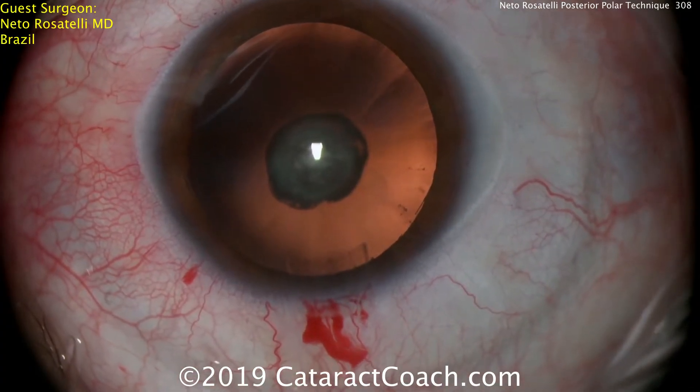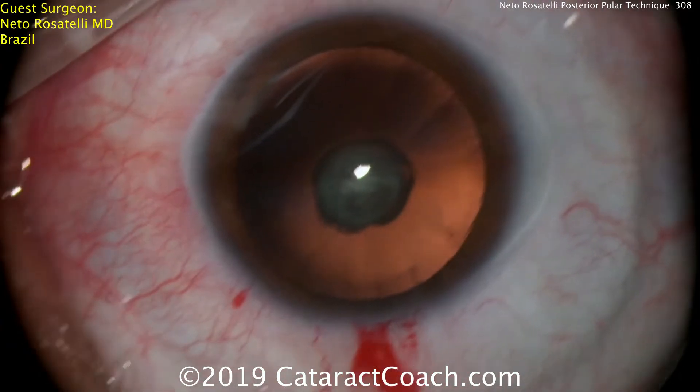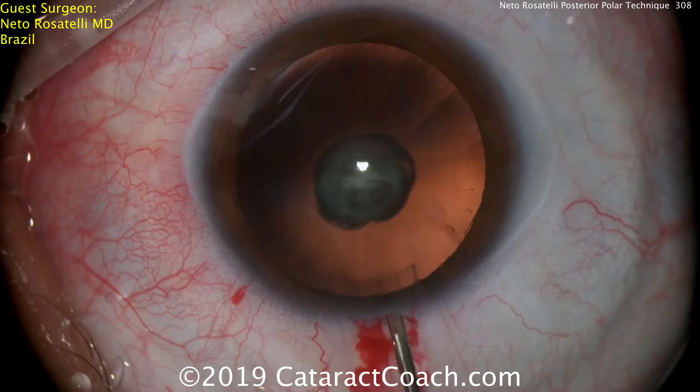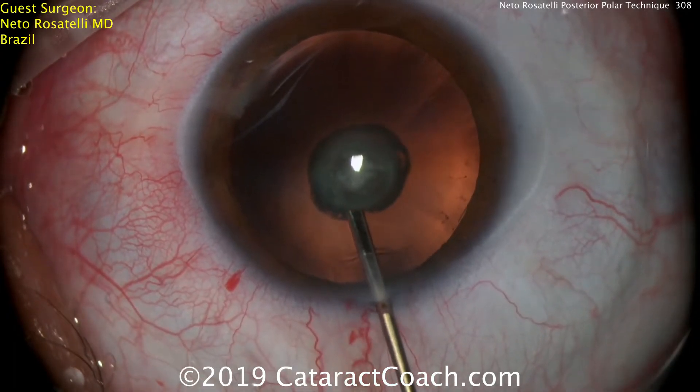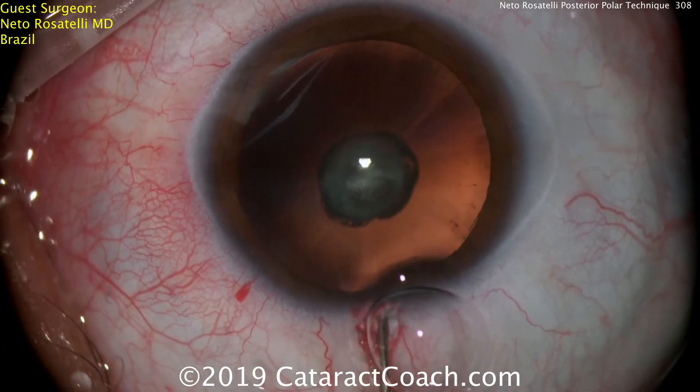This technique looks very easy, but it's actually a very difficult technique to learn. This surgeon certainly has a tremendous amount of experience. Filling the eye now — looks like probably anesthetic — and then here comes a dispersive viscoelastic.